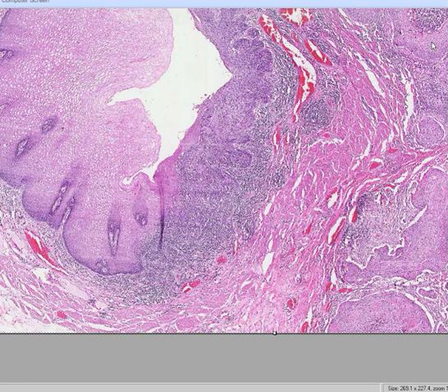Okay, last question. Let's say you don't care whether this is a squamous carcinoma or an adenocarcinoma. But let's say you looked very carefully at the muscle that the epithelial cells were invading.